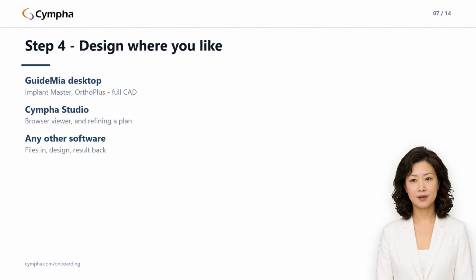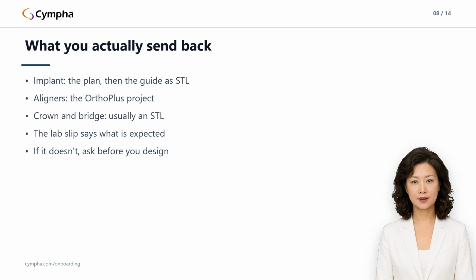Cympha Studio is the browser option. Be clear about what it is: a 3-dimensional viewer and the browser companion to Ortho Plus, good for inspecting a case and for refining a plan, rather than a replacement for desktop CAD. And the third option matters most for an experienced technician, any other CAD you already use. Pull the files down, design as you always have, send the result back. No lock-in, and no requirement to abandon a tool you are quick in.